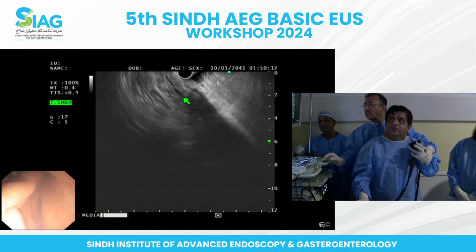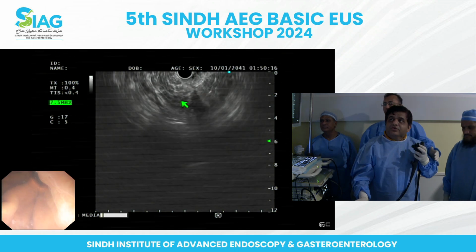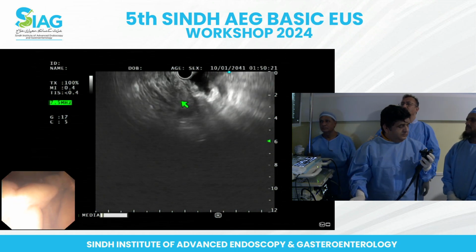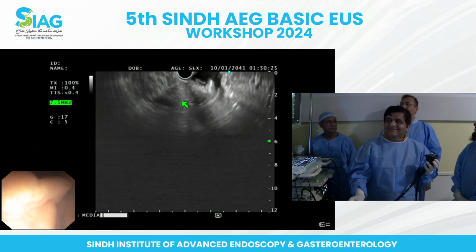This is, we are going down towards the head region. Some of you have a tendency to inject air in the stomach. Okay, right. So now go to the next station.